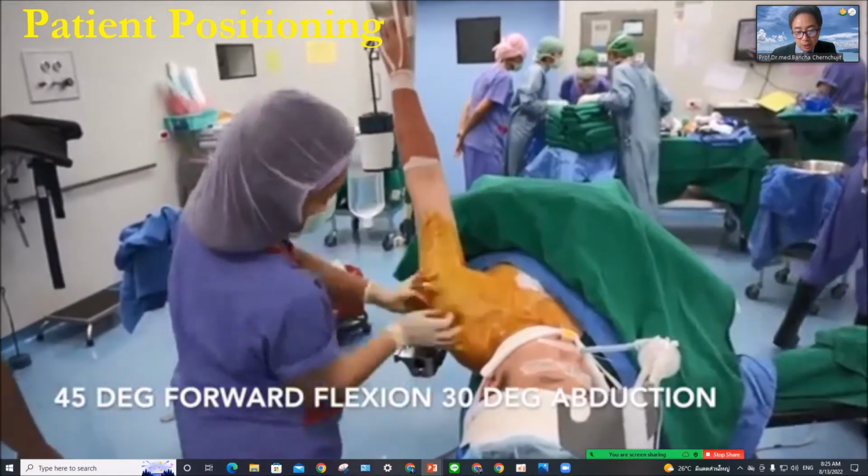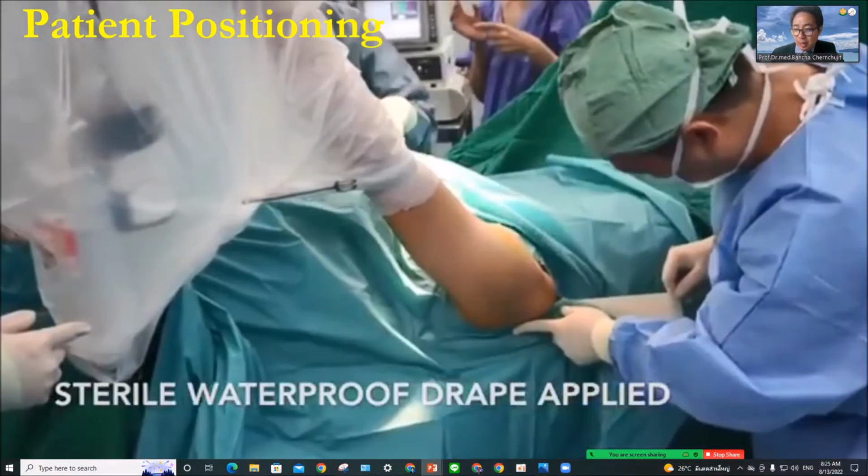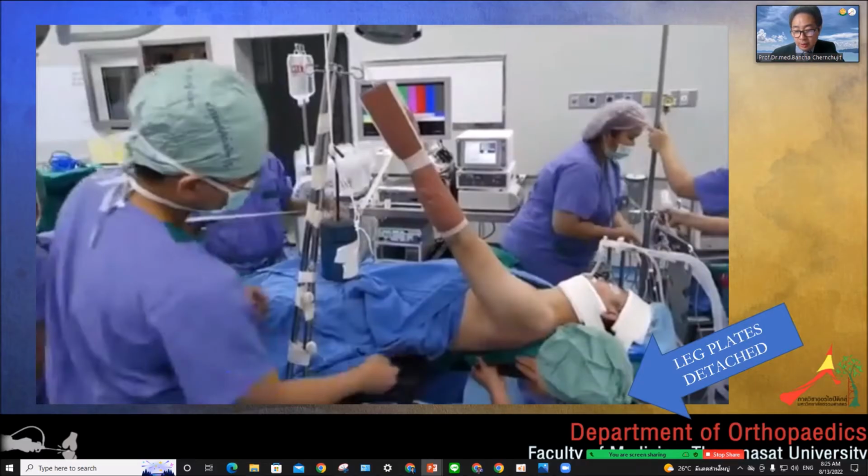This position is quite easy because you can also do open surgery, and you have less gravity effect compared to the beach chair or lateral decubitus position. The leg plate is detached like this, and you have enough room to work.